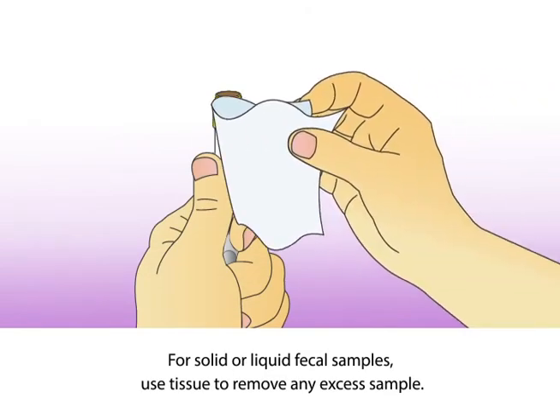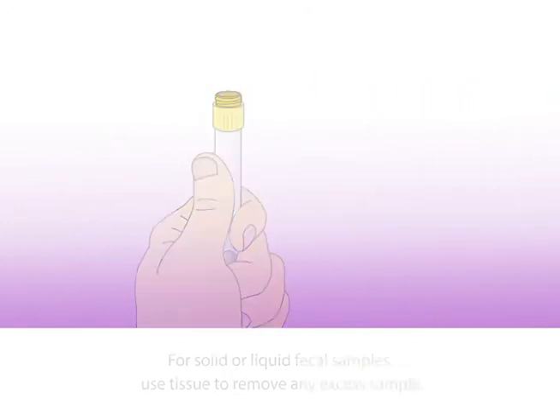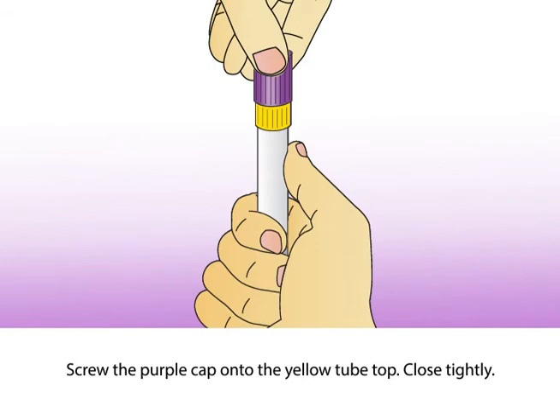For solid or liquid fecal samples, use tissue to remove any excess sample. Then screw the purple cap onto the yellow tube top and close tightly.